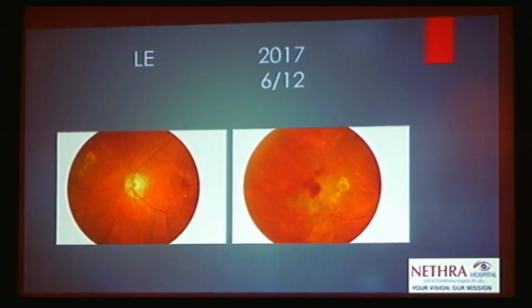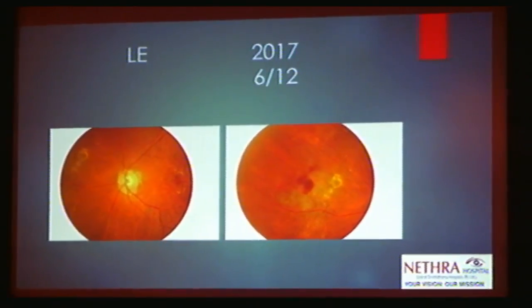Usha, I would do an angiogram in this patient. I think that's the basic thing you need to do to study what is happening in both the eyes. Whether that will give you the answer as to whether the left eye is the peripheral form of the disease that you're looking at in the right eye. Even in the right eye, it's more away from the fovea rather than near the fovea. This could be PEHCR, that's possible. So do an angiogram, and then whatever it shows, you can take it forward from there.